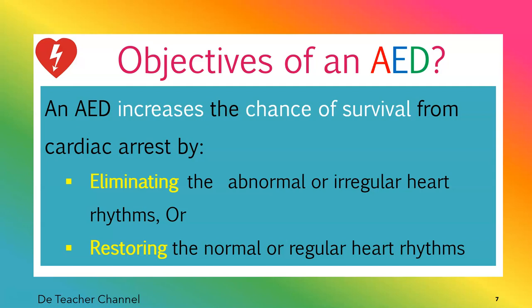Again, this machine is capable of eliminating the abnormal or irregular heart rhythm responsible for cardiac arrest, and in the process restores the normal or regular heart rhythm. Those are the objectives: elimination of abnormal or irregular heart rhythm, or restoration of normal or regular heart rhythm.